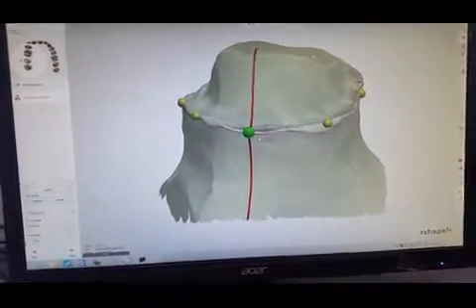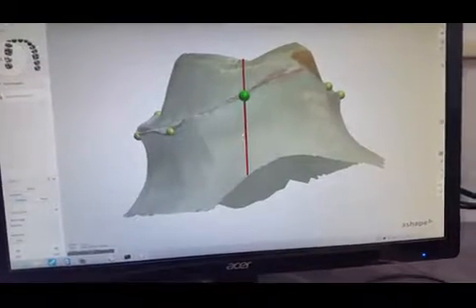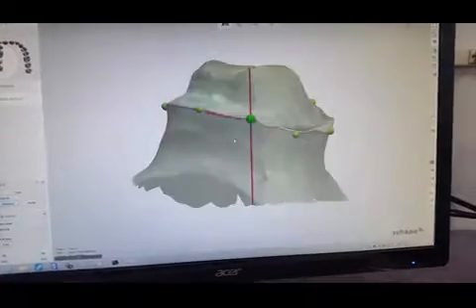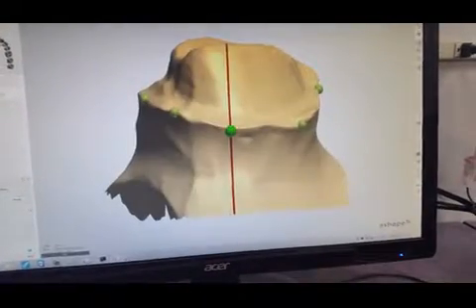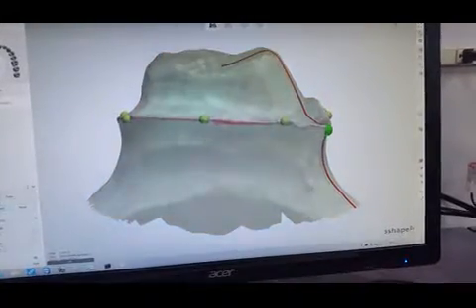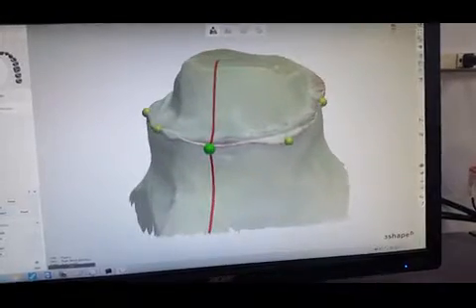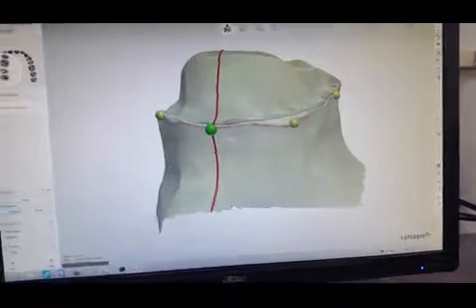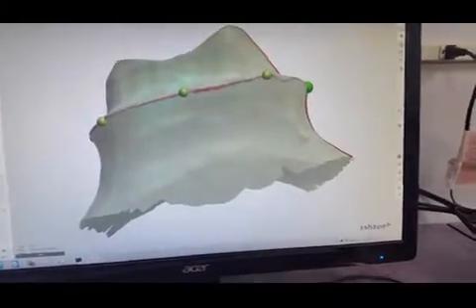Now we're going to identify where the margin is, and with this 3Shape 900 it actually scans real images, but I could also go to the diagram mode, which is this, and I kind of use both when I'm designing. Each one has its little advantage, and I try to use every advantage I'm able. And that looks good. We're going to proceed.